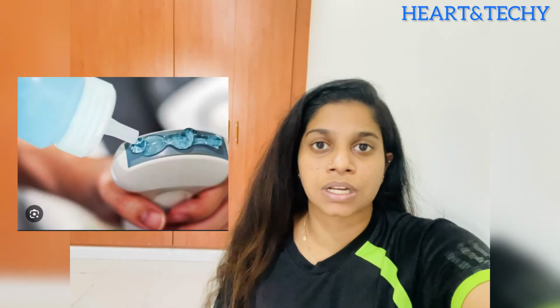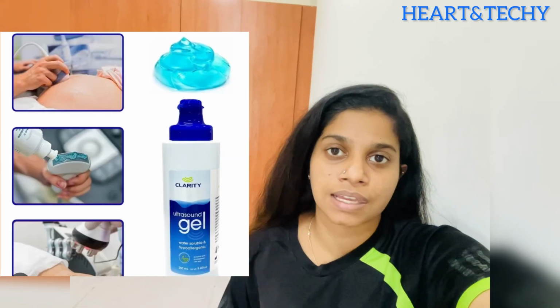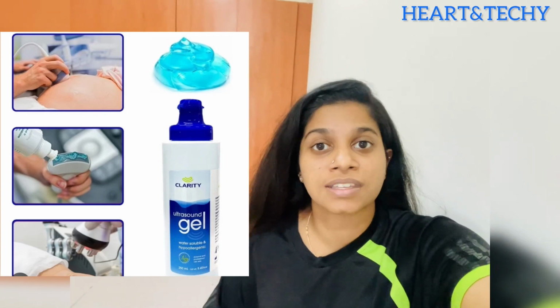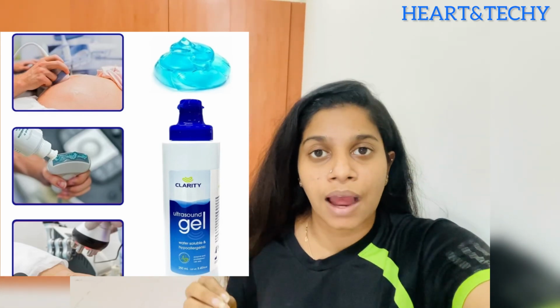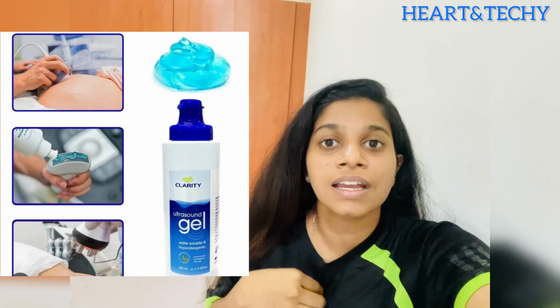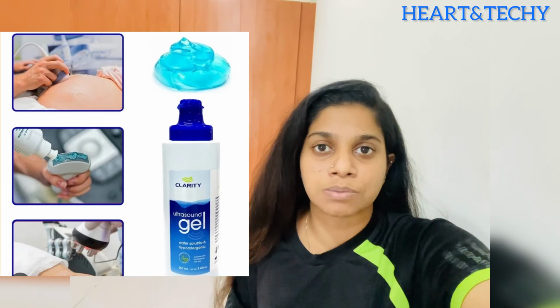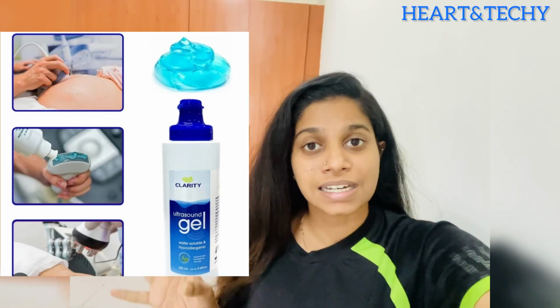So it needs a medium for the transmission, and the medium we use is gel. Whenever we are doing a scan on a patient, we have to put some gel on the probe and do the scanning in order to get a proper image, because for transmission it needs a gel.